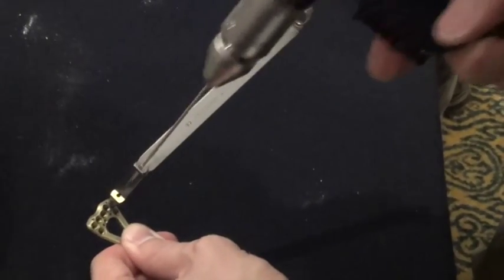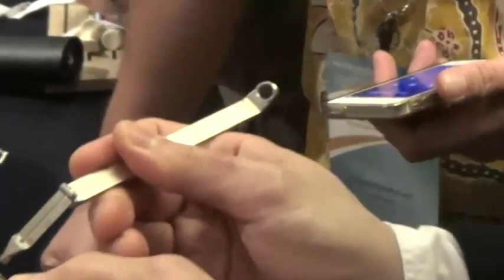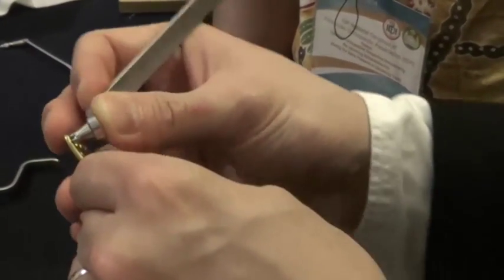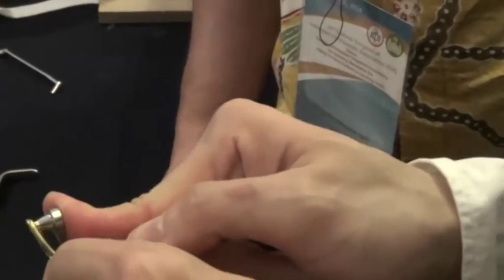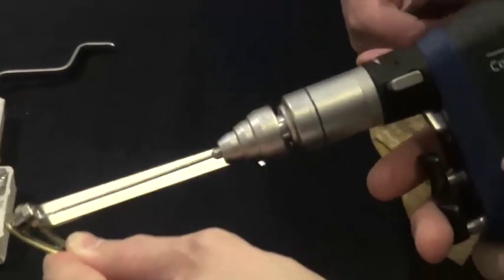Fixed angle again, you must put it in the correct position. You have to sit it correctly, nicely. Then you drill the hole like this. This is straight, right? This is neutral. There's no variable angle. So I will use this one for 1, 2, 3, 4, and the last one I will use the cone. Again, you must make sure this is fixed in the right position like that. See, it goes in tight. Then you put variable angle towards the radial styloid.